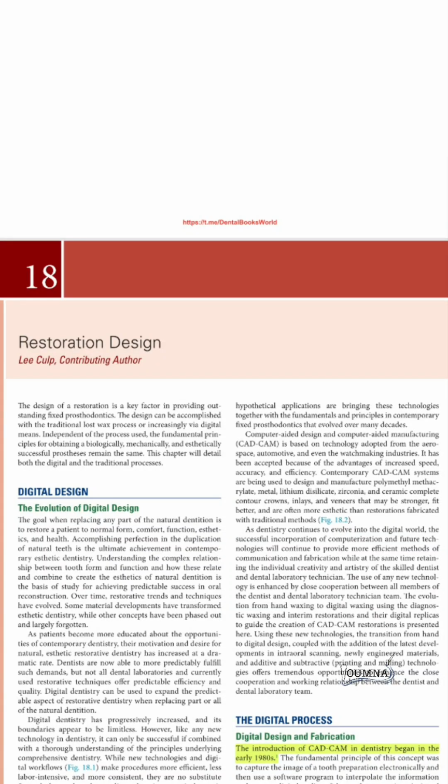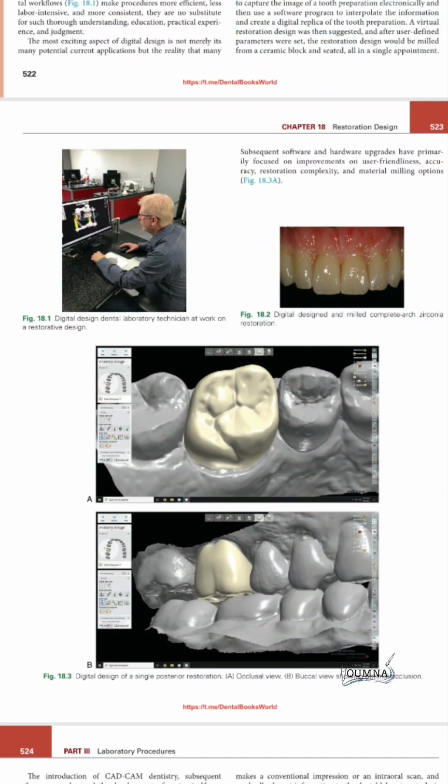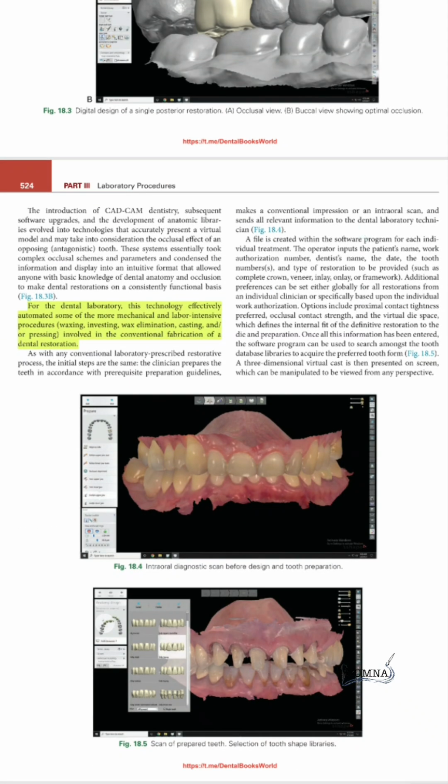In this chapter, we will discuss the restoration design. The most common method nowadays is the digital process. CAD/CAM has been introduced to dentistry since the early 80s, and this technology has automated some of the more mechanical and labor-intensive procedures like waxing, investing, wax elimination, casting, and pressing.